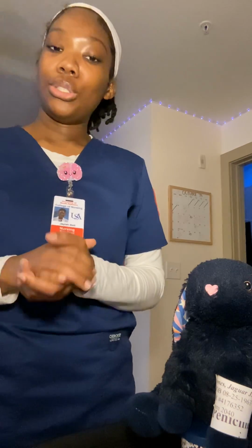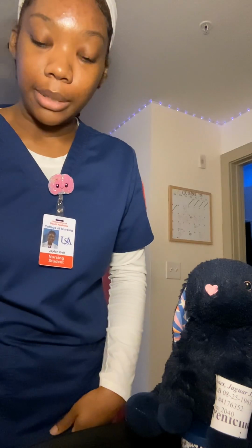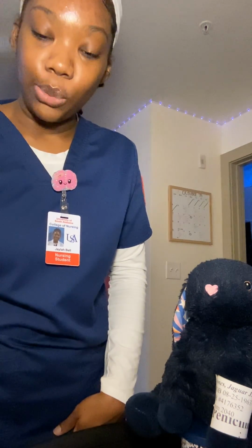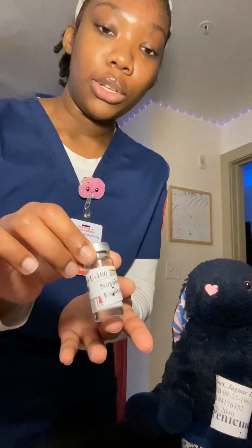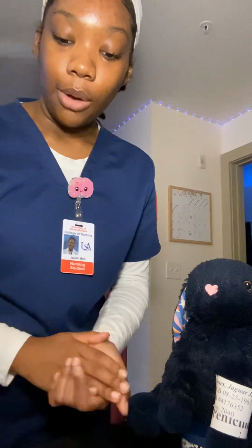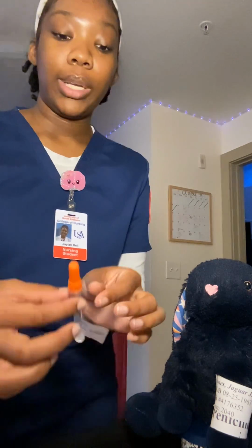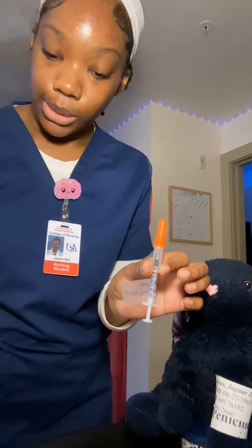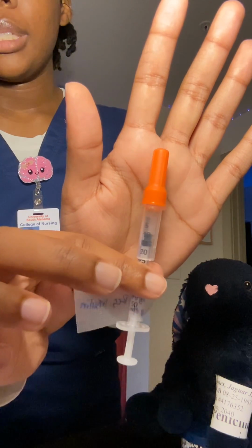All right, so just gonna do hand hygiene one more time, and I'm going to finish my third check of the 7 rights. So now we're going to do the right medication. It does say Novolin R, regular insulin. For the right route, I'll be giving it subcutaneously, and I do have the correct syringe and needle for that. For the right dose, it does say 10 units, and I do have 10 units of that insulin in this syringe.